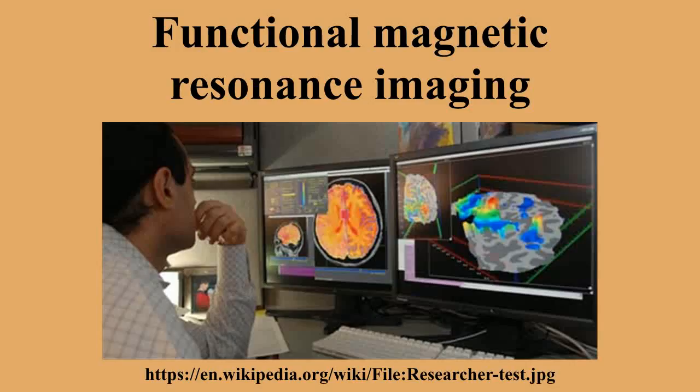The blood flow change is localized to within 2 or 3 millimeters of where the neural activity is. Usually the brought-in oxygen is more than the oxygen consumed in burning glucose, and this causes a net decrease in dHb in the brain area's blood vessels. This changes the magnetic property of the blood, making it interfere less with the magnetization and its eventual decay induced by the MRI process. The cerebral blood flow corresponds to the consumed glucose differently in different brain regions.